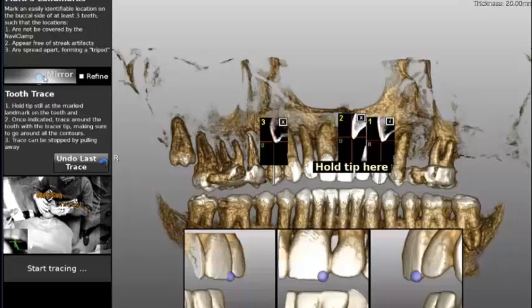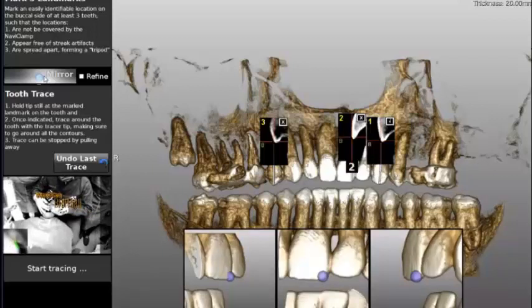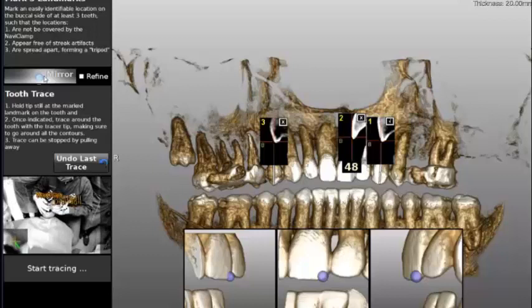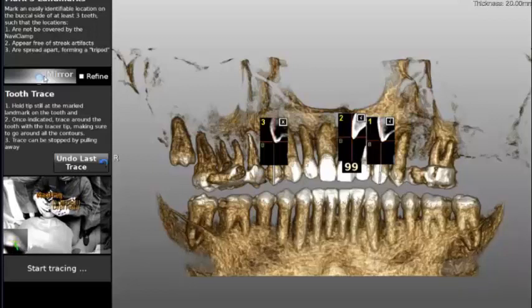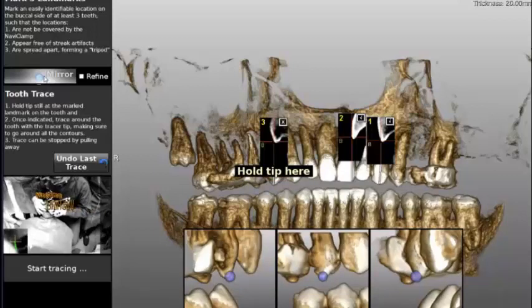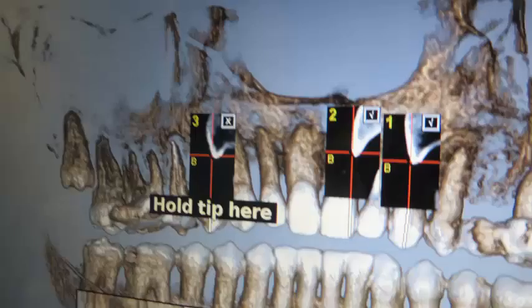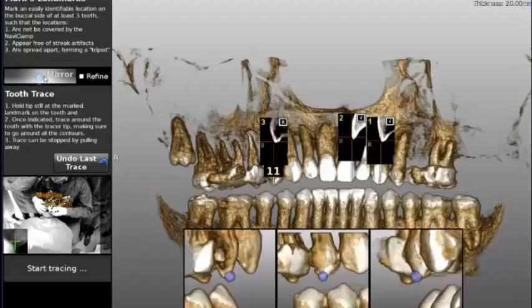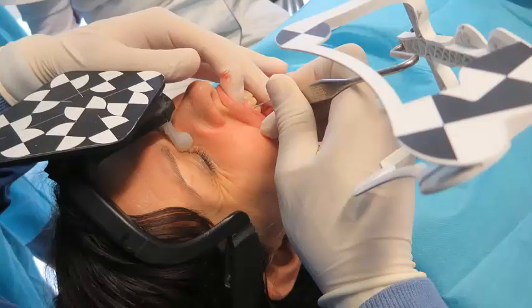The movement of the surgeon is not by simply pointing on the teeth, but just like drawing on the surface of the single tooth. Therefore, we get 100 points on the second tooth, and we are ready to move on to the third tooth. As we can see on this snapshot, there is a flag on the first tooth and an X on the third tooth to show that we need to accomplish the tracing of that tooth again, carried out using the tracer.